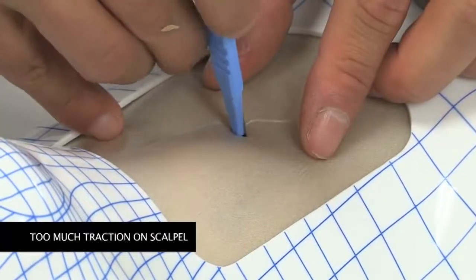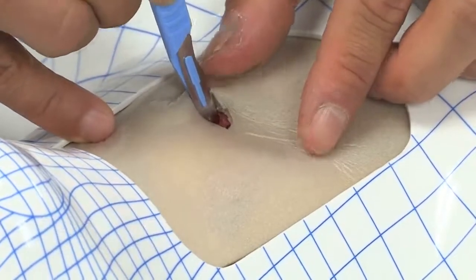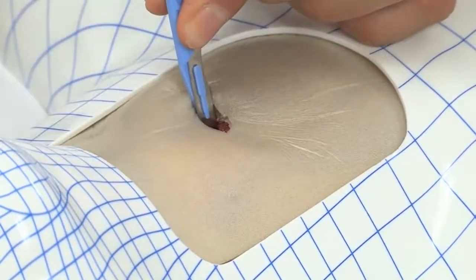After the stab incision, too much traction on the scalpel will narrow the incision, possibly rotate the trachea and can make the insertion of the bougie more difficult.